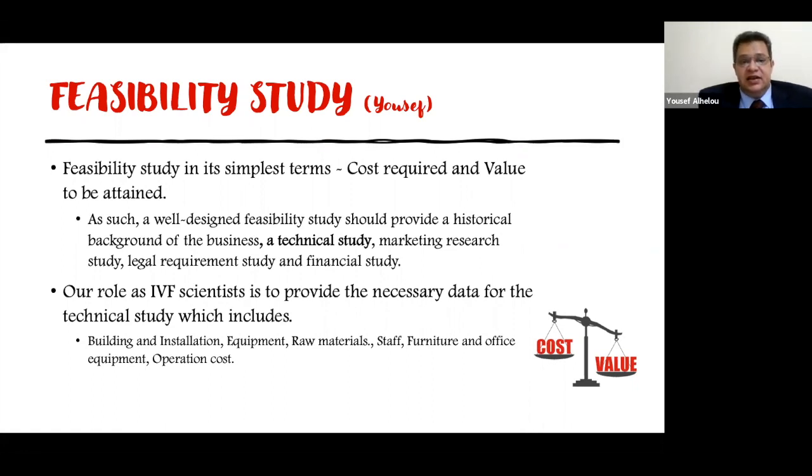Third is the legal study. Legal study, usually the legal requirements are the longest in any IVF project I did, because it takes a lot of time to get approvals from the official bodies. And our part as IVF scientists is the technical study.